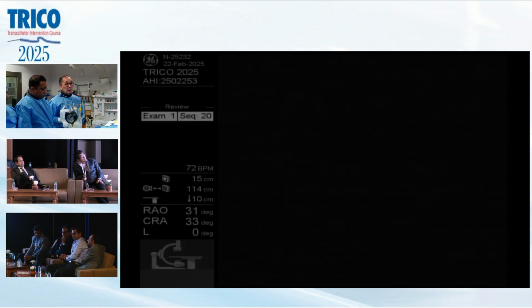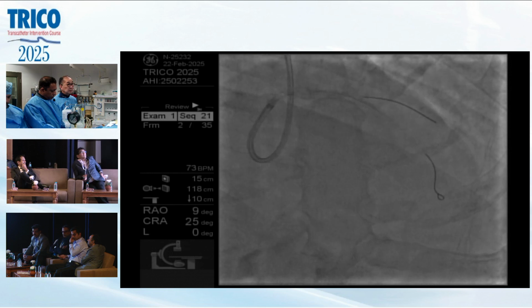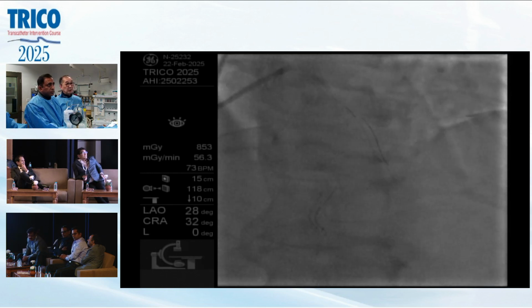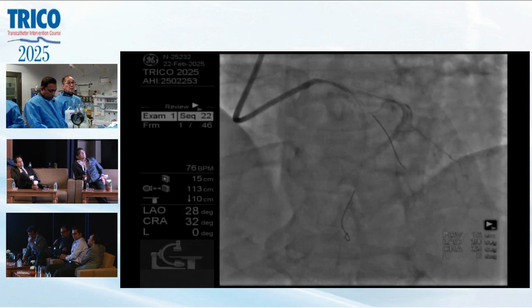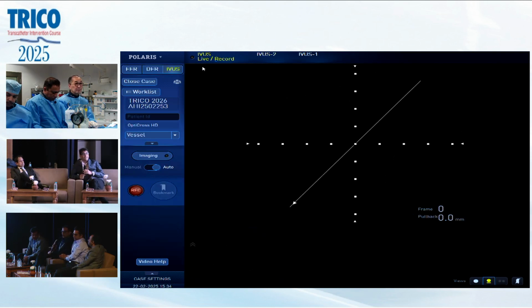Okay, good. Can I see one more? Cranial. Yeah. Then we do our IVUS. Okay, ready? So, what do you think I should do? At what stage would we pull out the diagonal wire or recross it, if you have to decide to do something? I mean, do we want to do something?